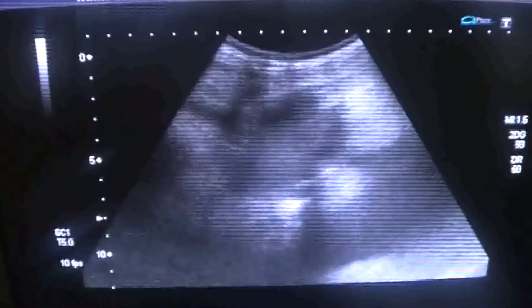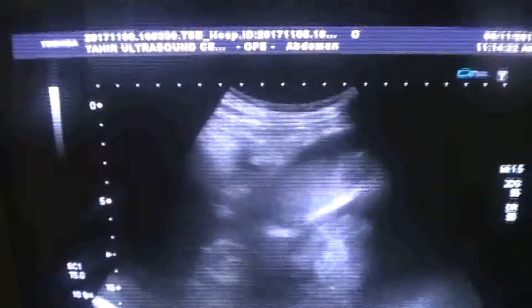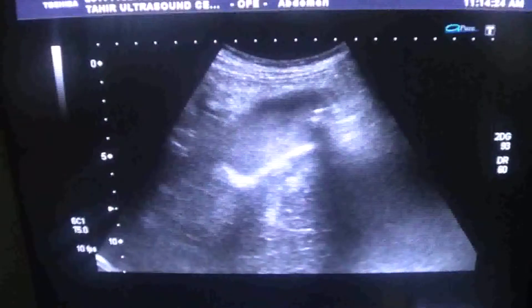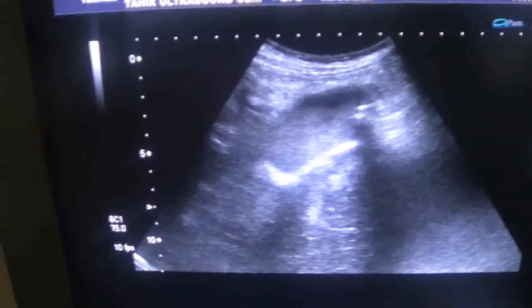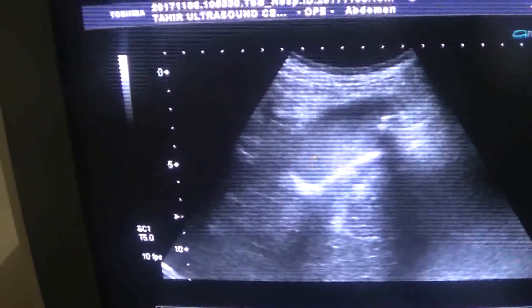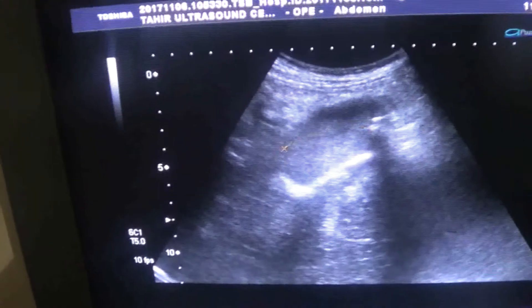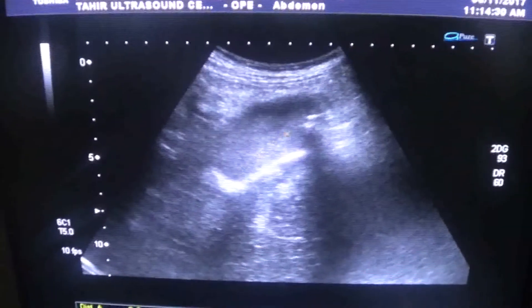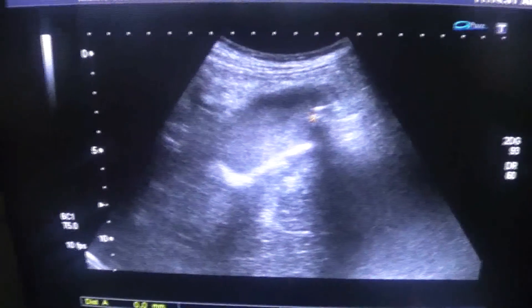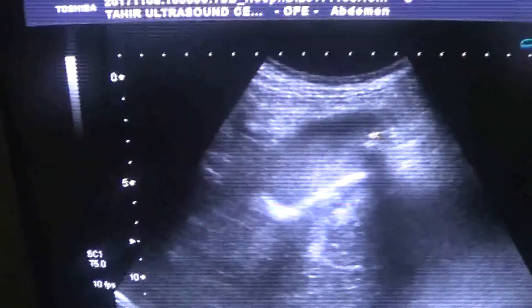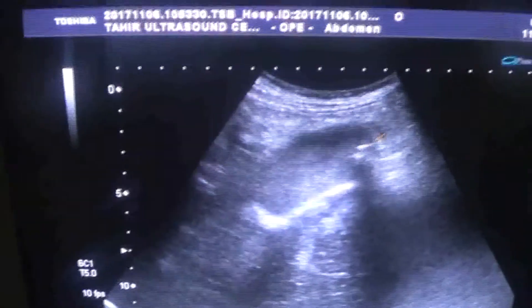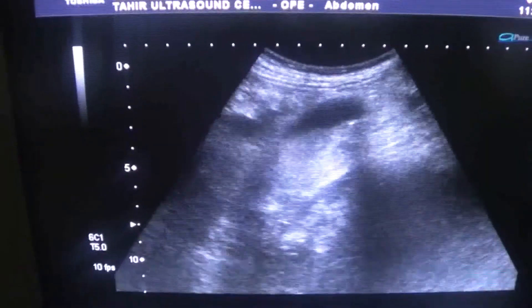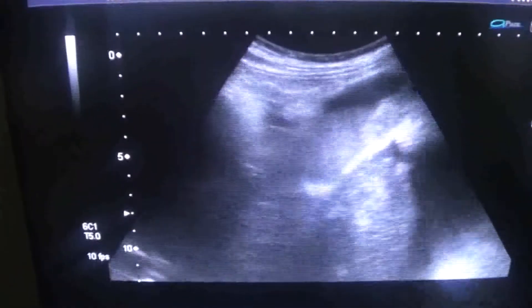Now this is the gallbladder. It's full of sludge with a few suspended tiny calcifications within it. It's almost filled with sludge, and these are two calcifications suspended within this sludge in the gallbladder.